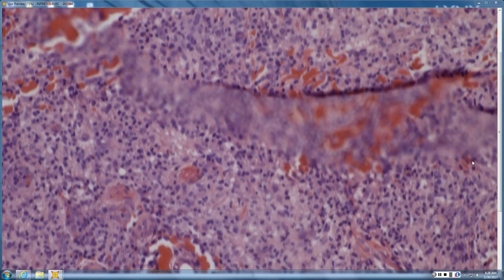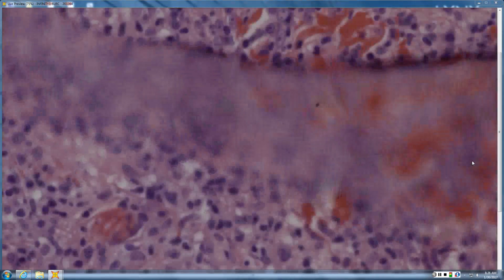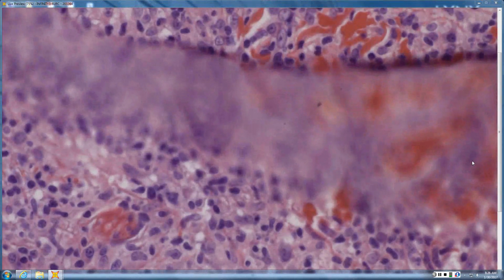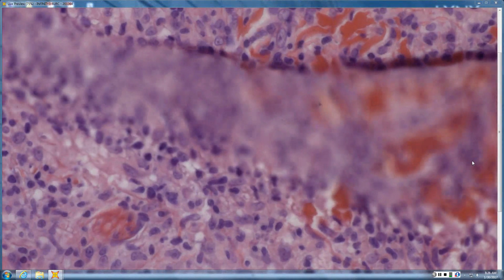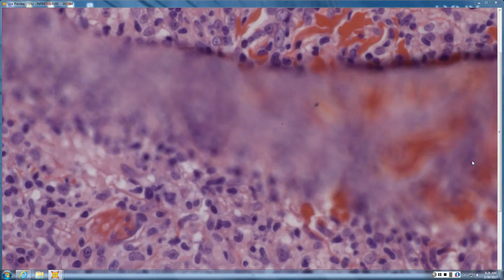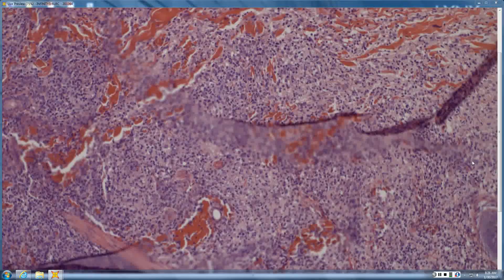They're not the best looking globi I've ever seen. Yeah, but I'd want to rule that out. Absolutely, you'd want to rule out leprosy. So you'd get an acid-fast stain. You'd hunt for any stain that might help you for leish. Giemsa just helps you see the kinetoplast a little more. Other than that, you see them pretty well in H&E.